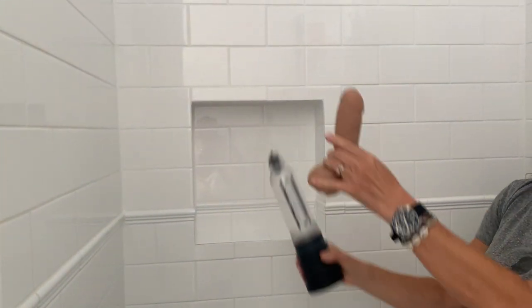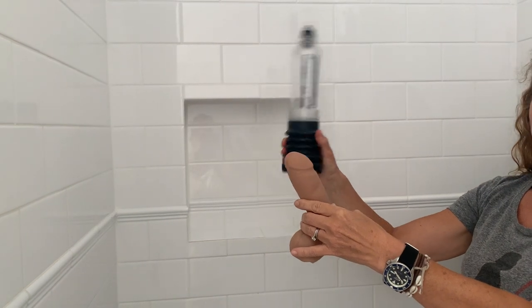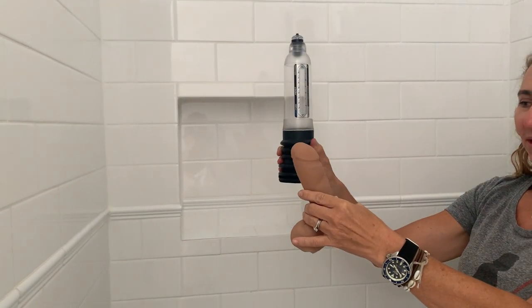This is a HydroMate penis pump and Geoffrey, and what we're going to do is teach you how to pump Geoffrey up when you're using the pump for rehabilitation.